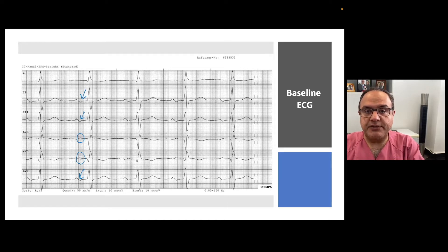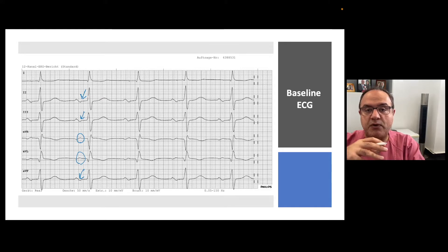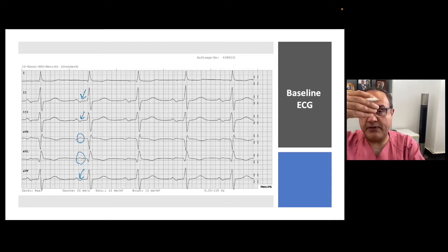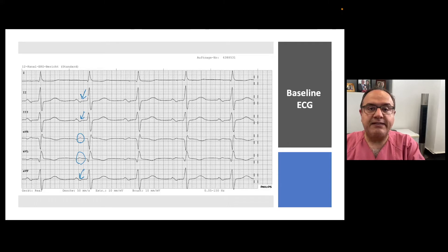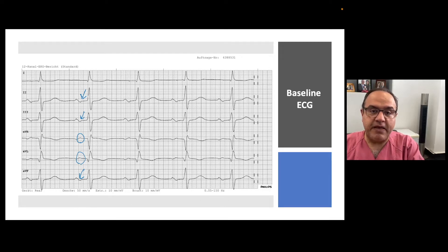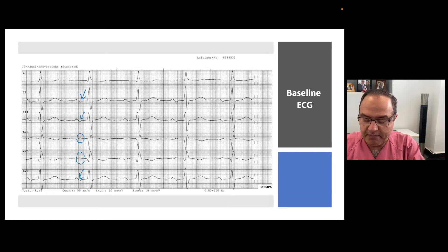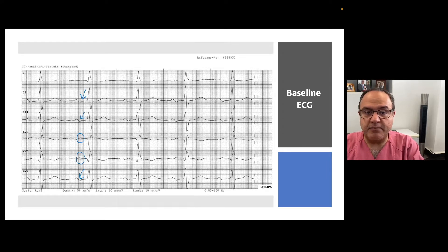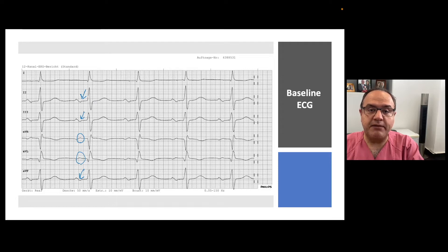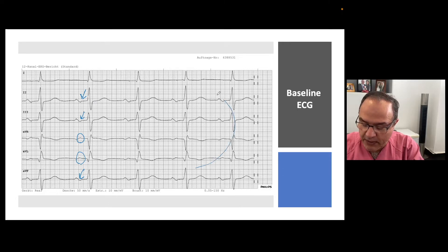Usually, interatrial conduction happens through the Bachmann bundle, so left atrial activation is from superior to inferior, and therefore the left atrial component of the P wave would be positive. But in this case, in leads II, III, and AVF, the left atrial component of the P wave is negative, which is the typical ECG finding in Bachmann bundle block.